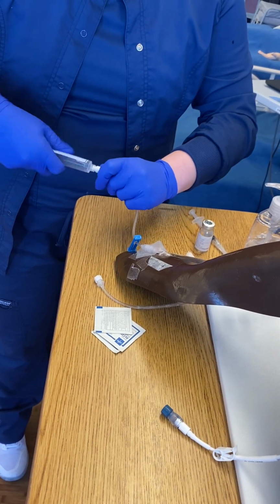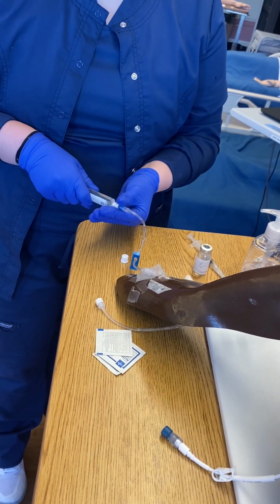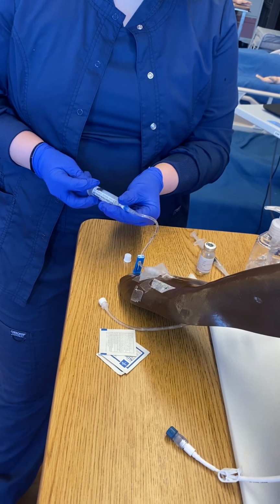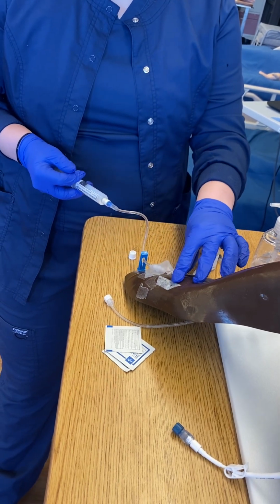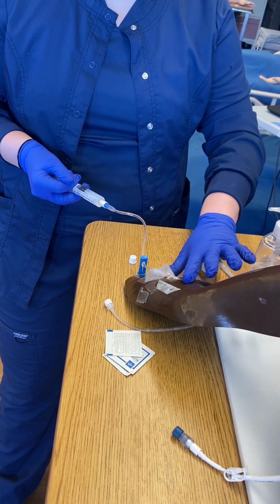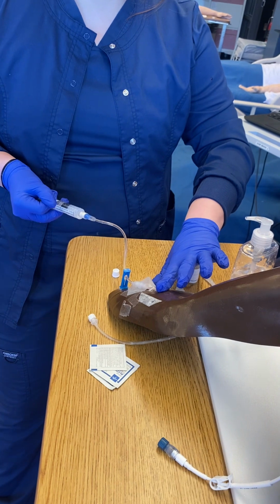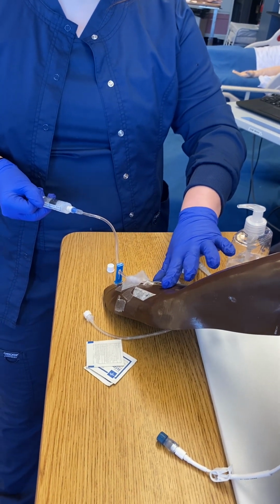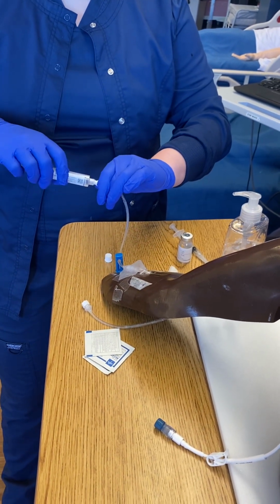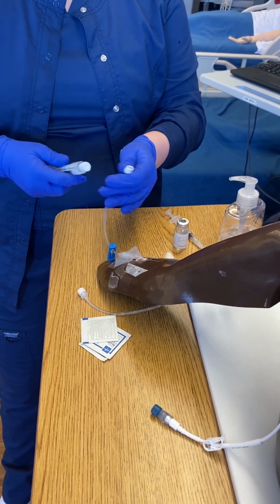Since this is the first saline push, I'm gonna do it for a quick, like 10 seconds, but just make sure I'm feeling along the IV site for infiltration as I'm doing this. Feels good. Perfect. So I'm gonna take this off. Cap it again.